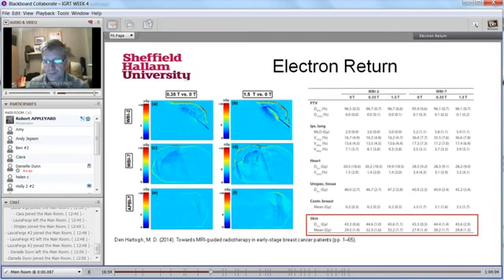Another example of this issue is skin dose, and it's highlighted at the bottom. As you can see, it's a fairly small but noticeable difference in skin dose where we've gone from treatment with 0 Tesla. Here, this is for whole breast irradiation with 2 fields, whole breast irradiation with 7 fields here. So 2 different techniques, and we're moving from 0 Tesla to increasing field strength. And you can see down here how that increases the dose to the skin.